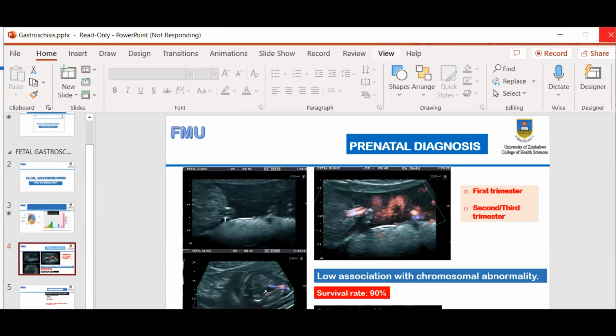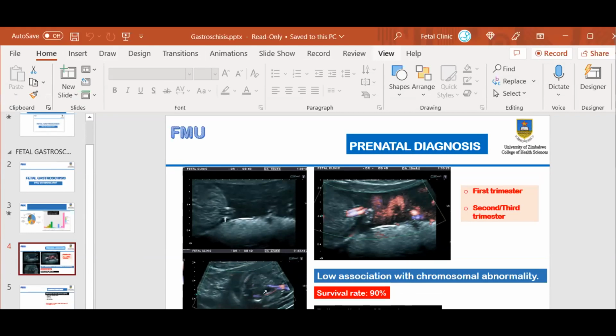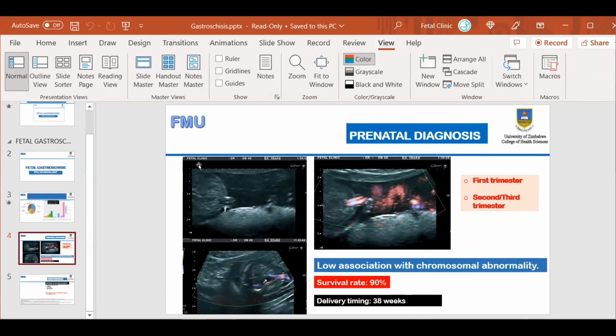When you go down, you are going to arrive at the position of the abdominal cord insertion you see there, where my cursor is right there. You will see 3 lines. That is normal. So the abdominal cord insertion is signified by those 3 lines. This is a very important image in screening for anterior abdominal wall defects. This is just to demonstrate the same image in color here. So that's the kind of image we need to screen for anterior abdominal wall defects.